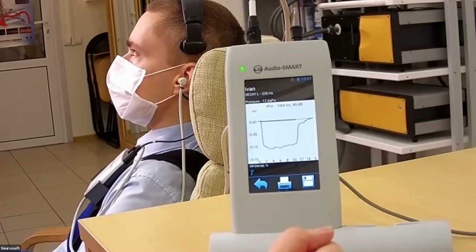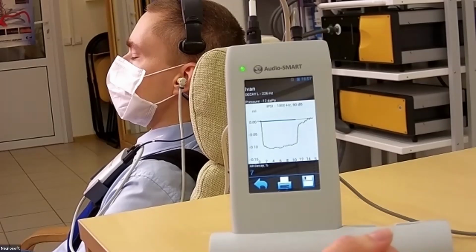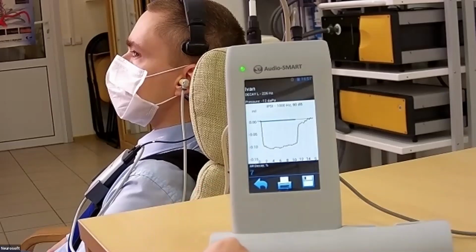Michael has said before that normal values are up to 50%. If it is more than 50%, it is about some inflammatory processes in the retrocochlear area, or if it is more than 90%, it is a vestibular schwannoma. For example, cancer in this area, retrocochlear, it's a very important site. Then you have more than 90% of decay. It's a normal picture.